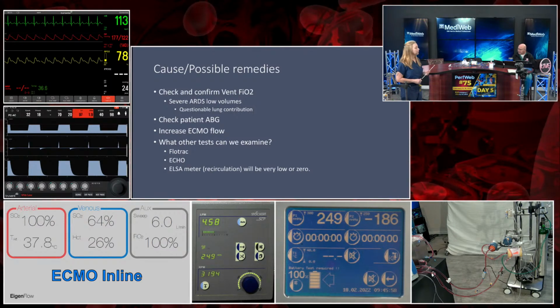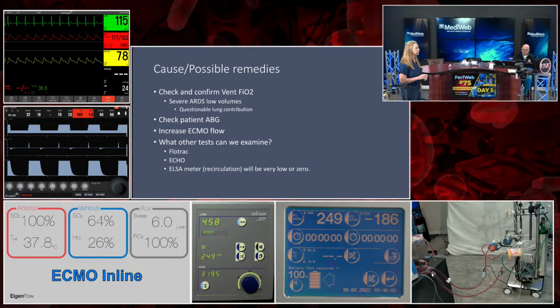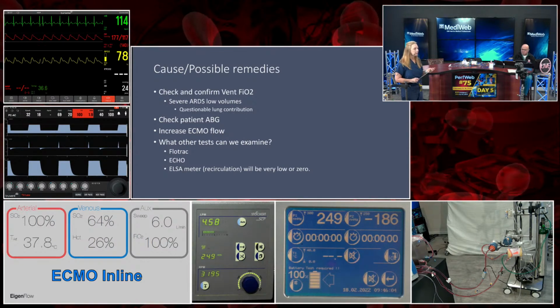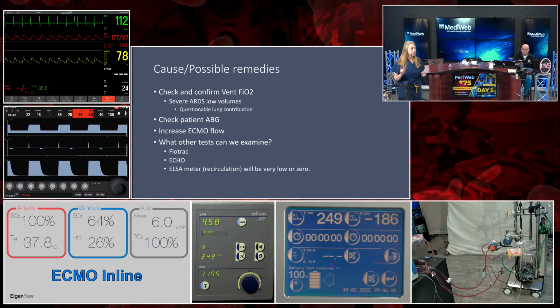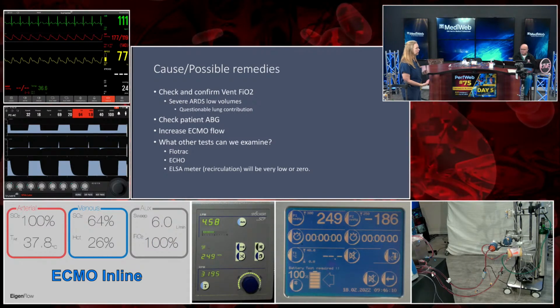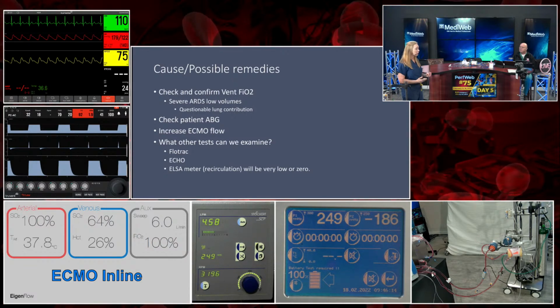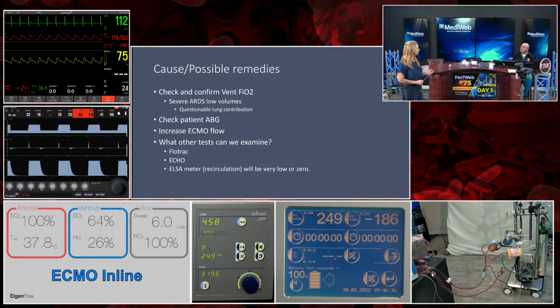Increasing your flow increases the speed at which blood comes out, and if you have a recirculation problem, it's just going to increase the recirculation.